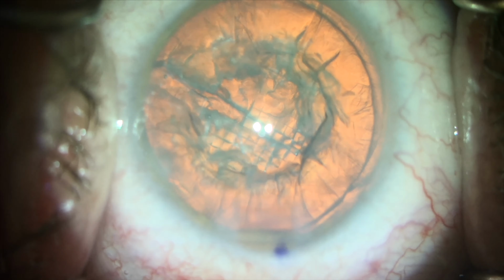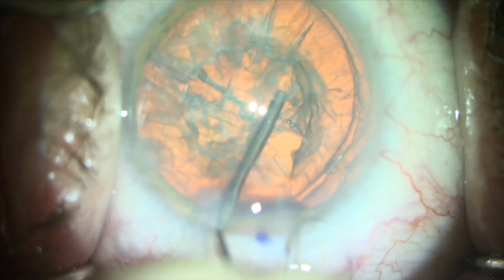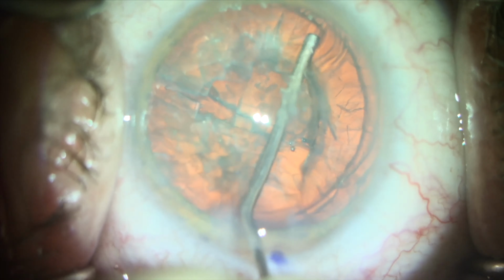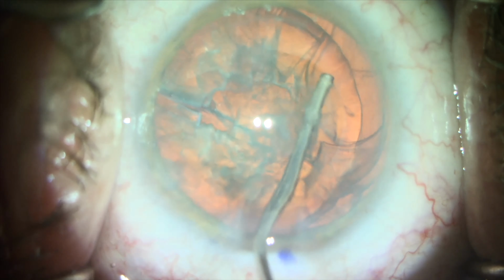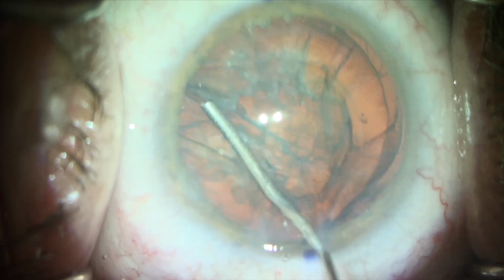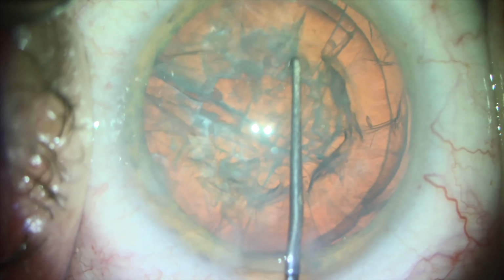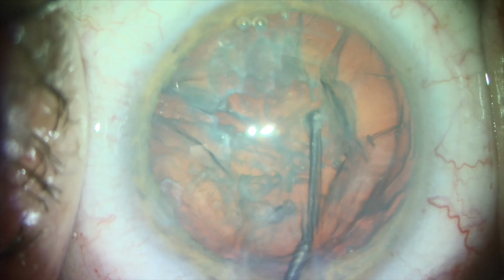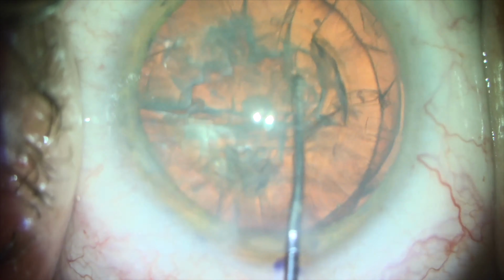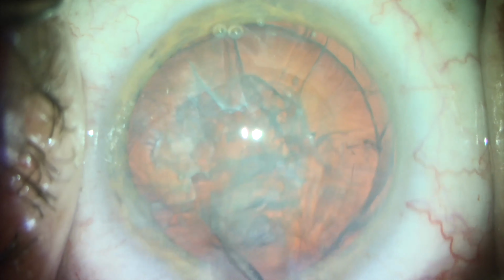We could forge ahead with the phaco tip and the second instrument to rotate, but somehow that seemed to be a little stressful on the nucleus and bag complex. If we infuse the eye with viscoelastic, it will allow us to move the nucleus without placing unnecessary stress on the zonules or the capsular bag complex. Here is our chopper, and we're just trying to rotate the nucleus another 90 degrees with the aid of viscoelastic to stabilize the anterior chamber of the eye.